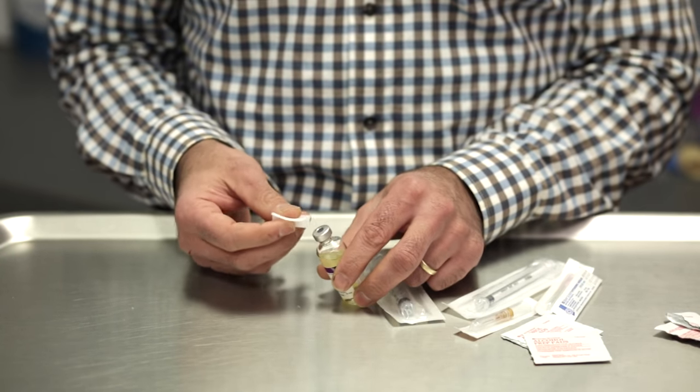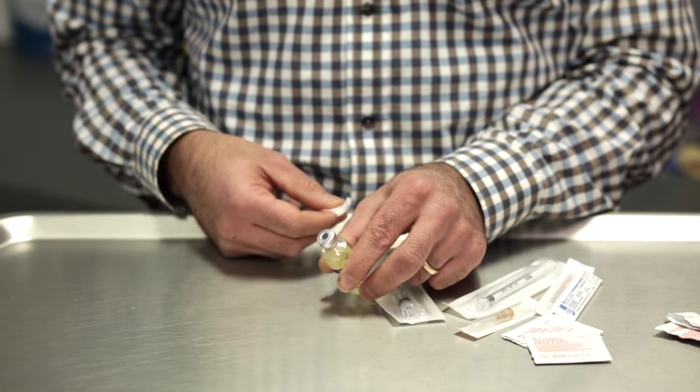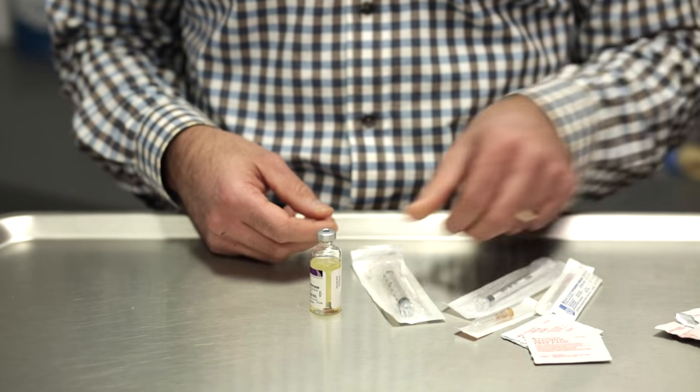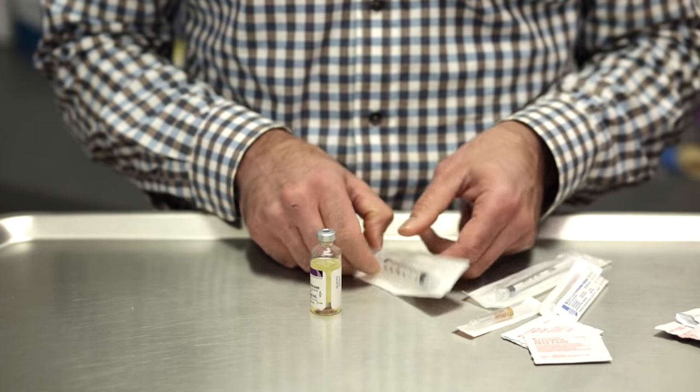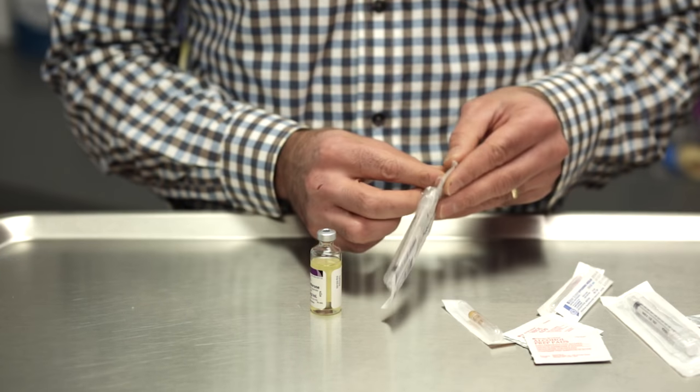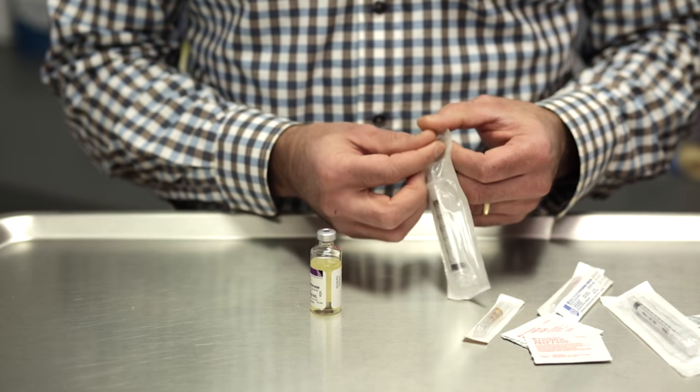Remove a swab of alcohol and cleanse the top of the rubber stopper to remove any bacteria. Depending on which syringe you've received, open up your syringe.